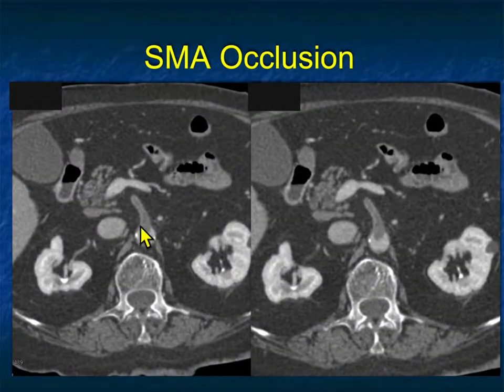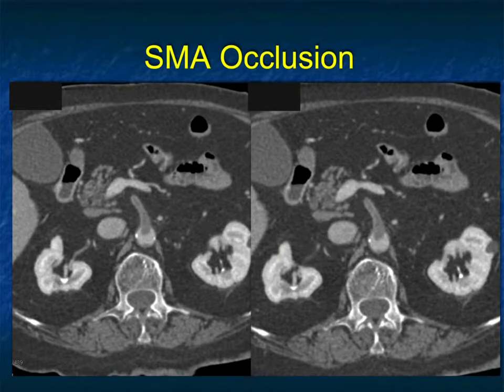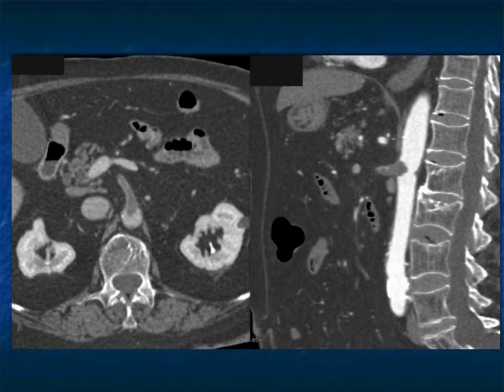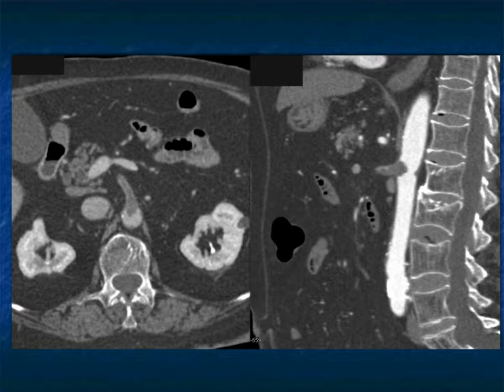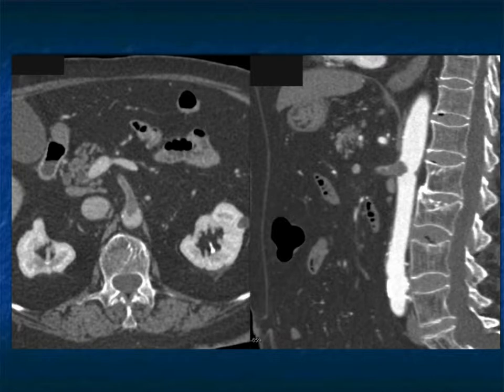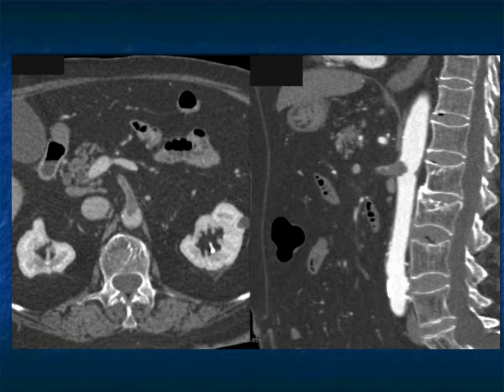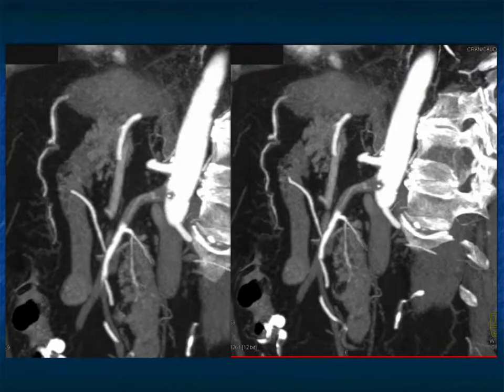In this example, the SMA is occluded proximally with thrombus also in the patient's aorta, nicely seen on the sagittal view. We always look proximally for narrowing or occlusion, but it's very important with both celiac and SMA to look distally, particularly with embolic phenomena. Often the occlusion is more distal — proximal changes tend to be atherosclerotic, but not always.